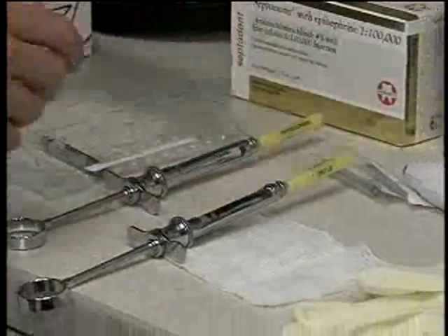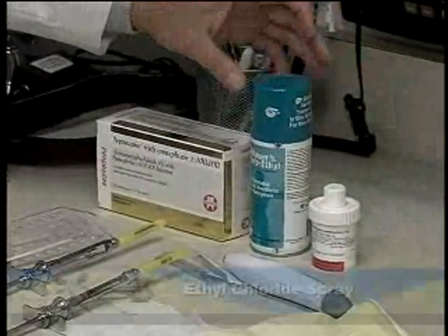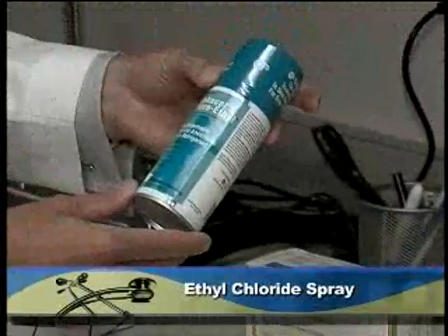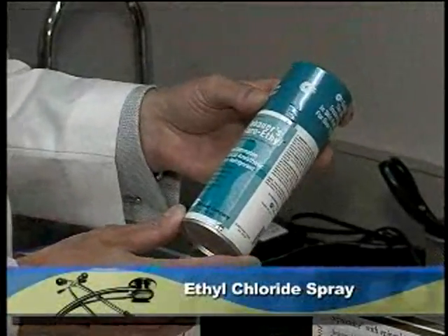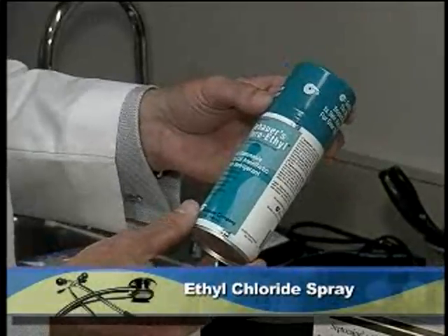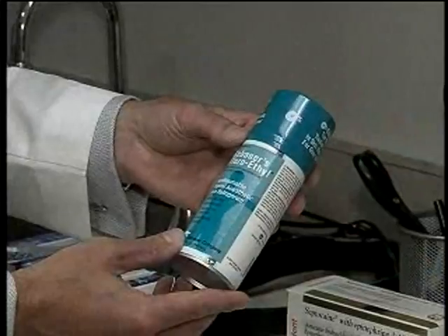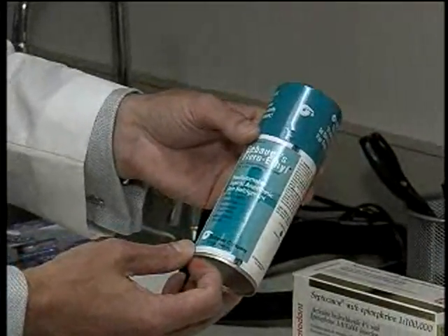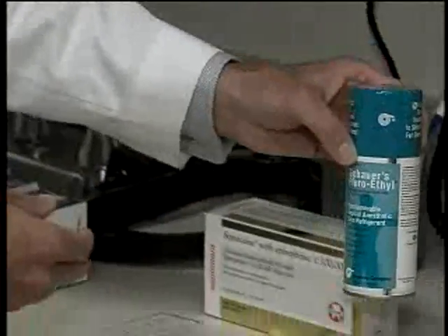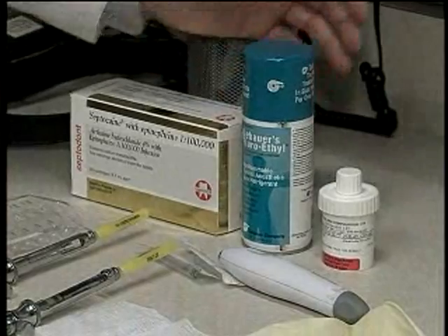I have my gloves. I also occasionally will use these topical anesthetic products. This is an ethyl chloride, and this product can be used to refrigerate or to freeze or to significantly decrease the temperature of the surface of the skin so the patients don't feel the injections as much. However, it does not work for the deeper dermal tissues, so they still will feel some pain, but it's something that we can use for patients who are uncomfortable with the feeling of a nerve block.